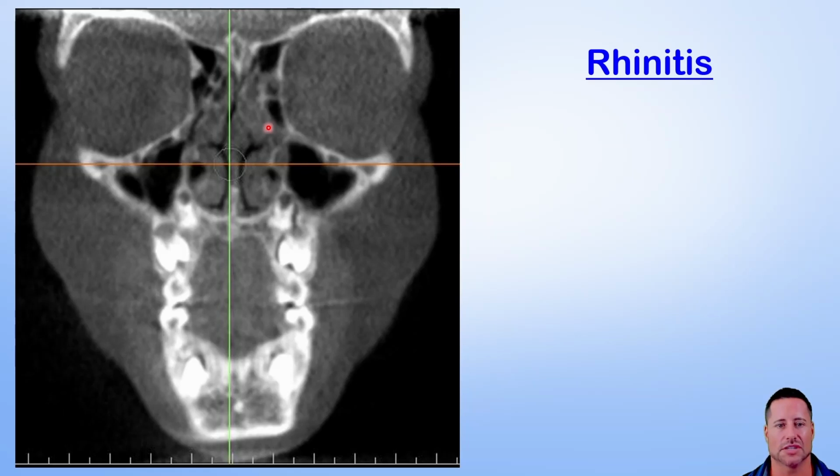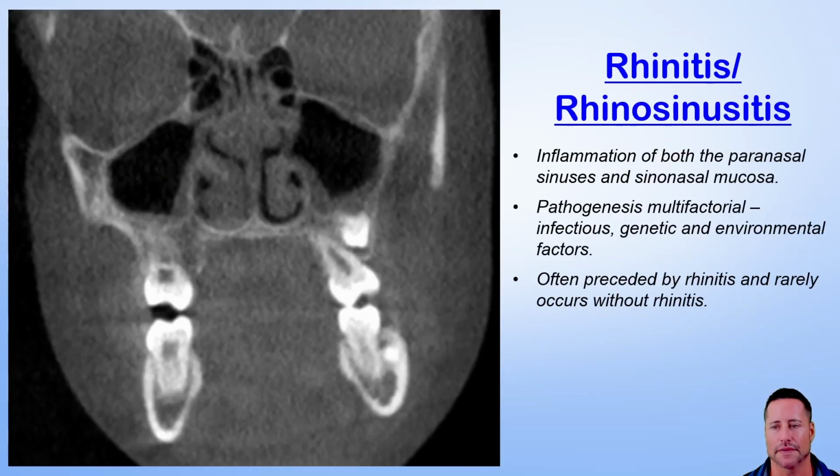You also noticed you can see some mucus up in those ethmoids. Again, different than just isolated turbinate hypertrophy. You have a different look in there. And then it can expand into the sinuses, which is when it becomes a rhinosinusitis. So you've got the inflammation, the mucus buildup in the nasal passageways, as well as some rimming and mucus buildup in the maxillary sinuses.